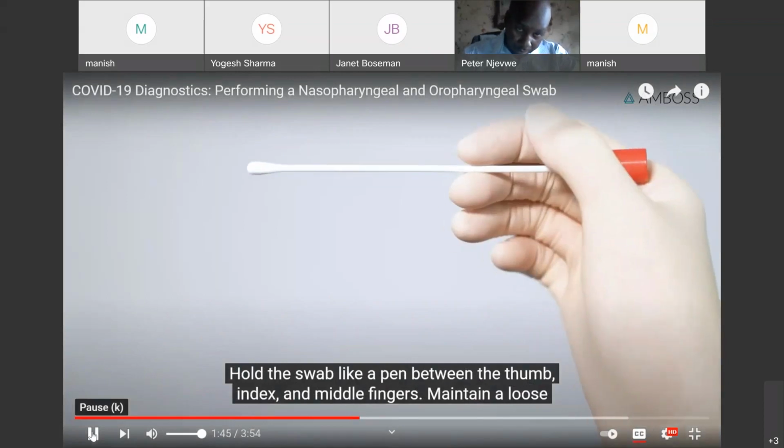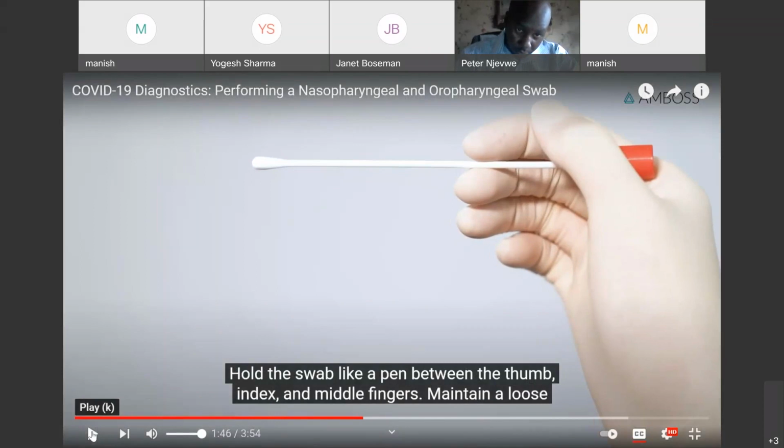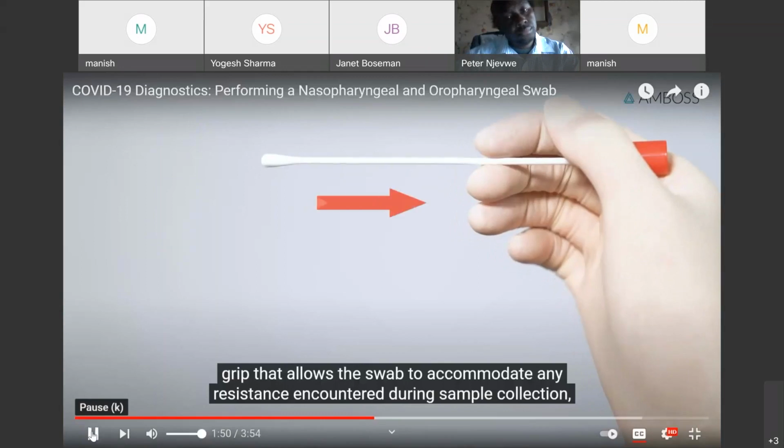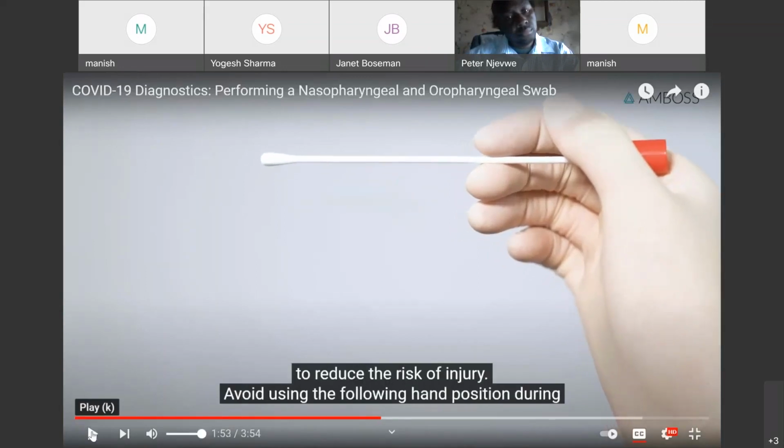So how to hold the swab? This is the technique for holding the swab. Hold the swab like we hold a pen, between the thumb, index, and middle finger. We have to hold it loosely, not with a very tight grip, and allow the swab to accommodate any resistance encountered during the sample collection. We know how much swab we have to insert inside the nostril, so we have to leave that distance and hold the swab from the back side.